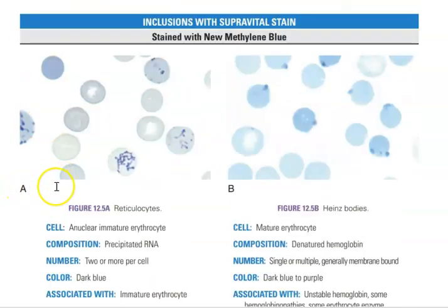So let's look at figure A here. In figure A, we're looking at reticulocytes. If you remember, reticulocytes are the step right before mature red blood cells. Usually reticulocytes have that bluish purple color to them anyway, but they will appear bluish colored because of the stain if you're using a supravital stain, in particular the new methylene blue. But also something that you'll be able to see in the supravital stain that you won't be able to see in the Wright stain with the reticulocytes is the remnants or the precipitate of the RNA. That's what these specks or stringy looking stuff inside the reticulocytes is: the RNA. I think we talked about it before, but you have to use a supravital stain in order to see the remnants of the RNA in the reticulocytes. Okay, so that's what you're looking at in figure A.